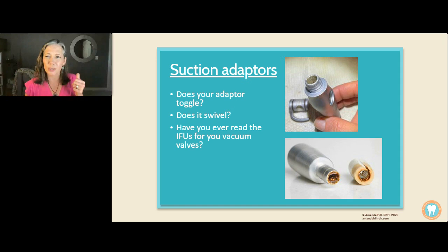And sometimes you notice they're really hard to toggle on and off. I never really thought about it. I thought it was different brands. Oh my gosh, what I've learned is they are caked with biofilm. This is actually from my office. You can see all the grossness that happened. I took them all apart, and I discovered all of this stuff inside.